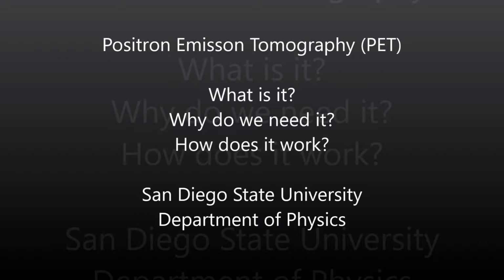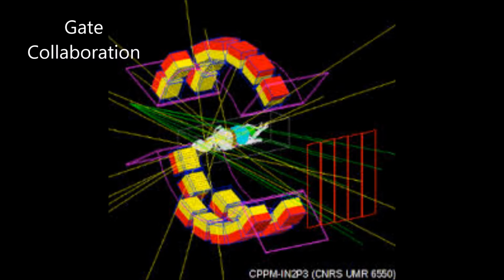What is positron emission tomography? Well, for a short brief, it is basically a way for doctors to visualize what is going on in your human body based off of a chemical reaction that goes on when they inject you with a chemical compound that usually has something to do with your glucose level.